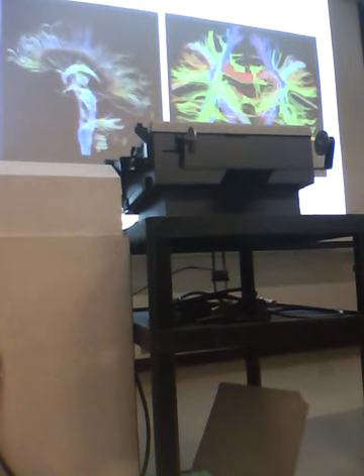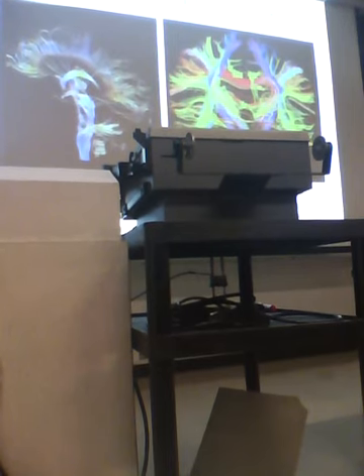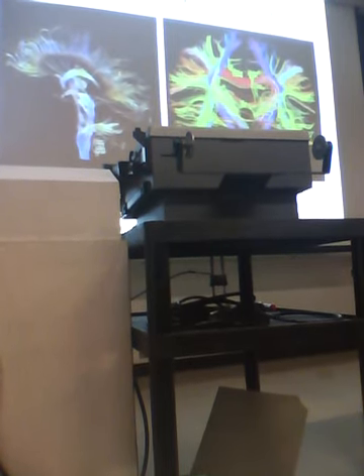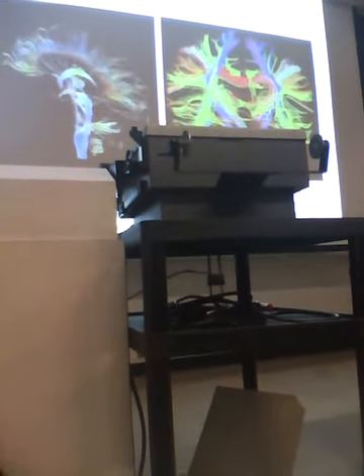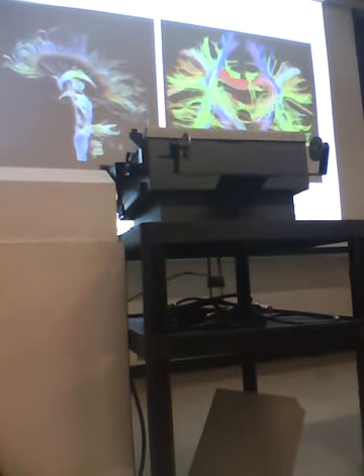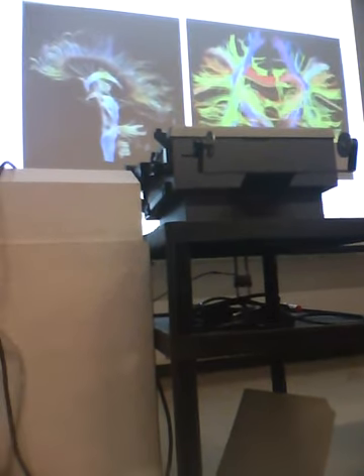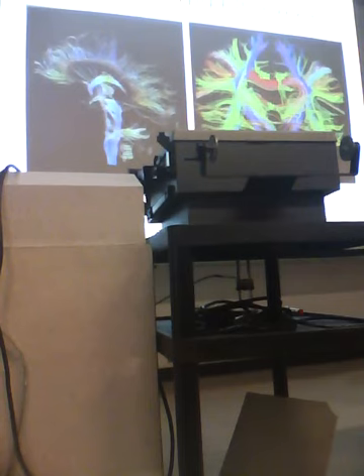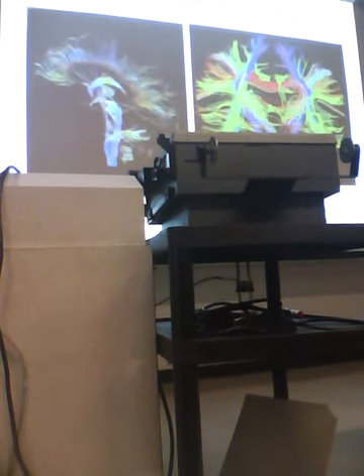Then, with a whole bunch of computing and analysis, and personally I don't know the technique exactly, the result is that you get these really spectacular images of the fiber tracts. These are artificially coloured, of course, for the different tracts going across the corpus callosum here. This enables you to examine the fiber tracts in patients, for example, and compare to normals, or you could study the normal change in the fiber tracts with aging.